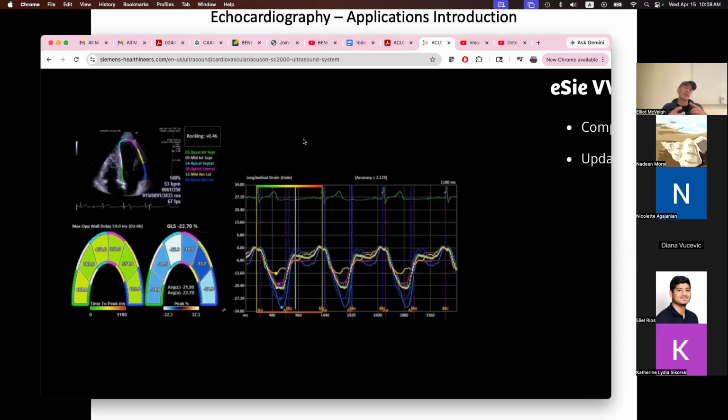Even the flow in the ventricle, when you see it, it can have a very random looking pattern. When the mitral valve opens and the flow goes down into the left ventricle and it refills, it goes down at a certain angle and it hits the apex and then swirls around, right? So it's a flow you would imagine is kind of random. It should have random components. But when you actually do a velocity map and you use like 30 heartbeats to look at that flow field, you actually get a coherent result. So that flow field actually reproduced itself about 30 times.